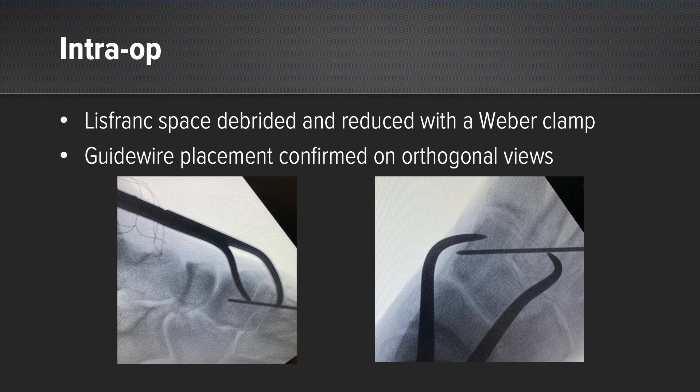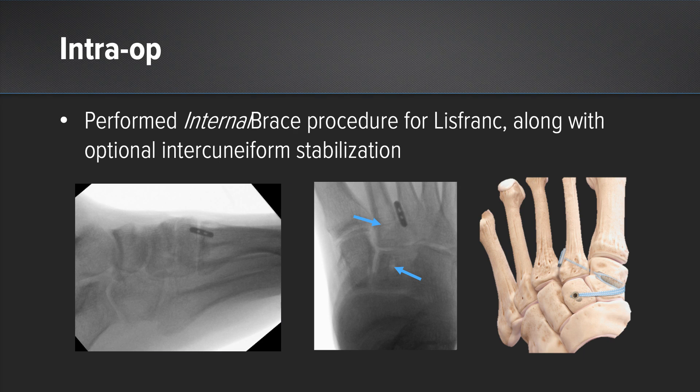We then returned to the stabilization of the Lisfranc injury by first removing some additional scar tissue at the base of the second metatarsal, then obtained an anatomic reduction and held this in place. We confirmed this under orthogonal images and placed our guide wire in a retrograde fashion from the base of the second metatarsal to the medial cuneiform. We then overdrilled the wire in the medial cuneiform and passed our button and suture tape material through the tunnel we'd created and secured this in place with a swivel lock. Since we found intercuneiform instability as well, we passed the suture tape over the medial cuneiform and docked this into the intermediate cuneiform underneath the extensor tendons to provide additional stability.